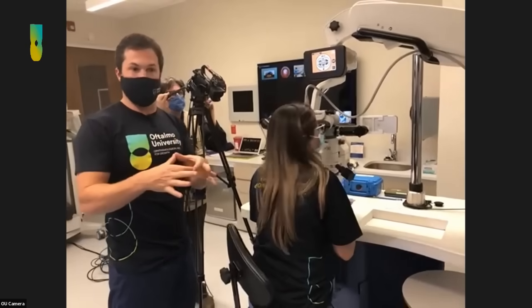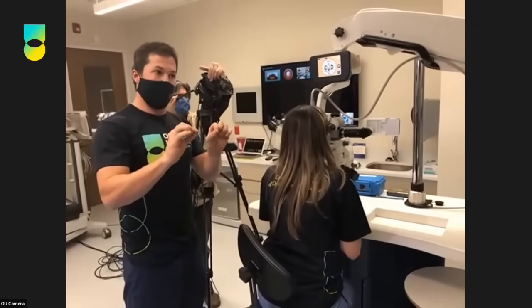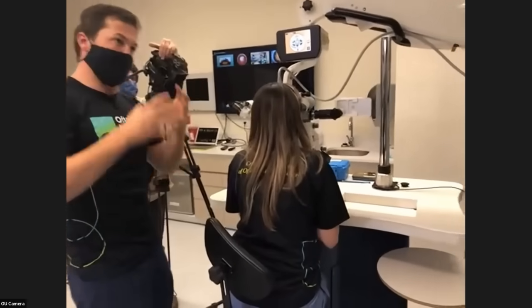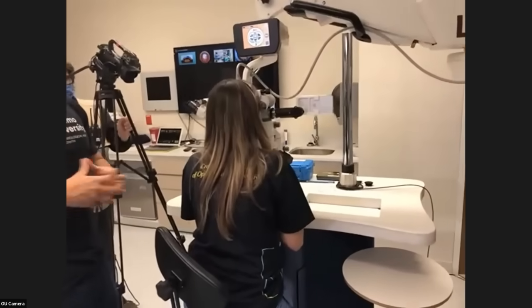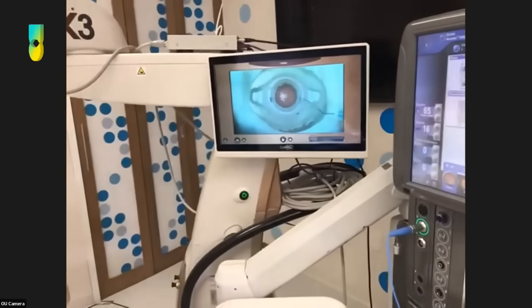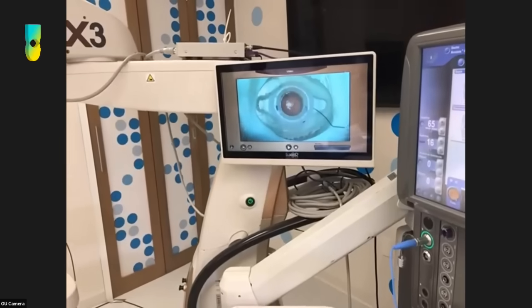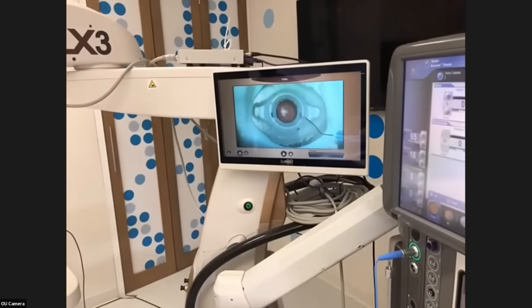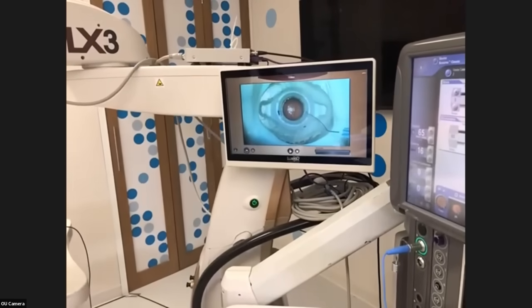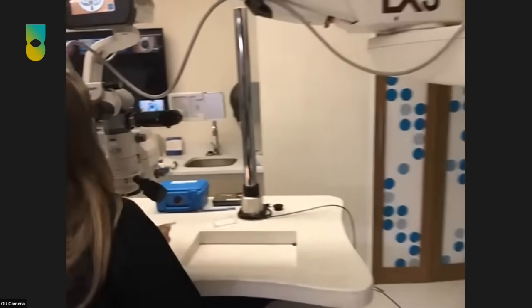We're gonna have a still eye, okay, with no incision, and we're gonna do a capsulorhexis. Then that eye is gonna be complete. We don't have a cornea now. Okay, we're gonna have a cornea and we're gonna do a capsulorhexis. Then we're gonna have a moving eye. Okay, and after the moving eye, we're gonna start doing some phaco. And actually, this is very important too because there is a difference between doing the right eye and the left eye. So let's come here with the camera.